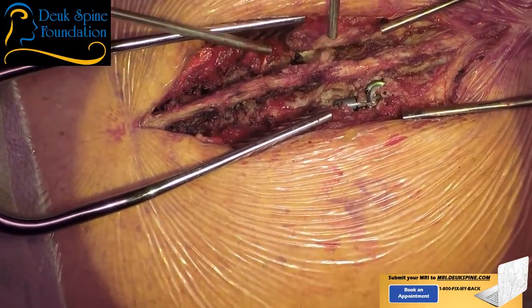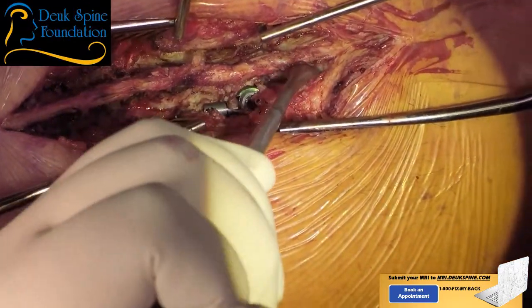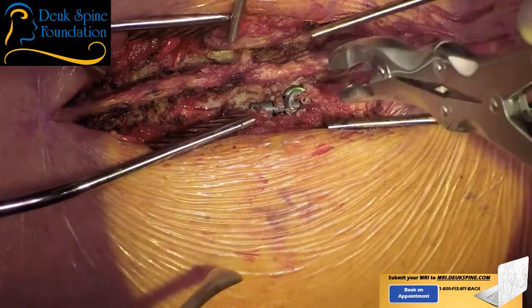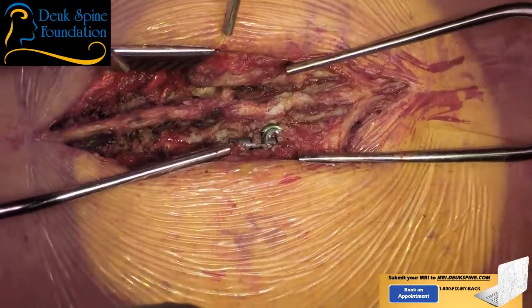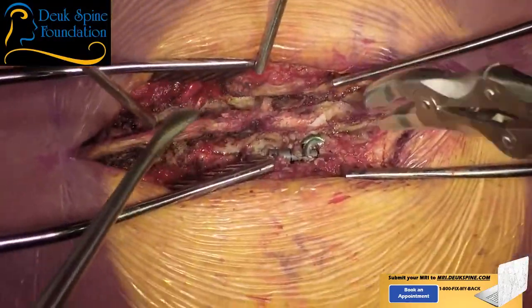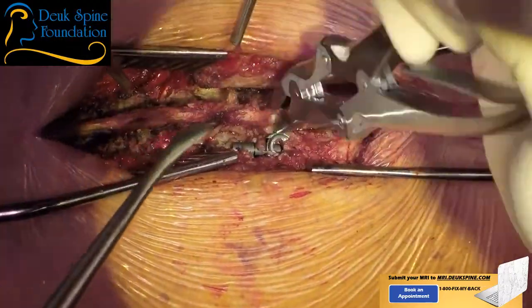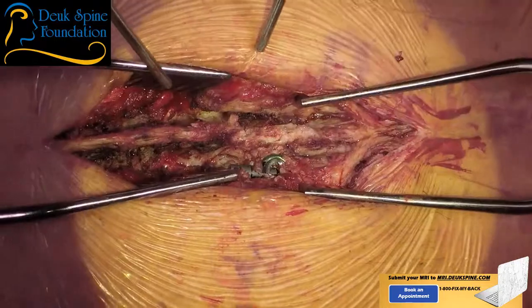All right. So, this should be the levels we're treating, here and here. Once again, there's some scar tissue here. Save the bone just in case we need it. I don't expect to fuse. Now, I'm starting what's called a laminectomy.